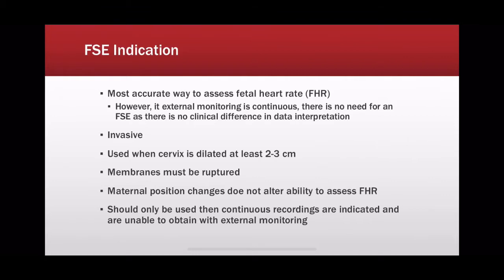Remember, this is an invasive procedure and needs to be used when the cervix is dilated at least 2 to 3 centimeters. The membranes have to be ruptured, and maternal position changes do not alter the ability to assess the fetal heart rate with an internal FSE monitor. And again, this really should only be used when continuous recordings are indicated and they're unable to be obtained with external monitoring.